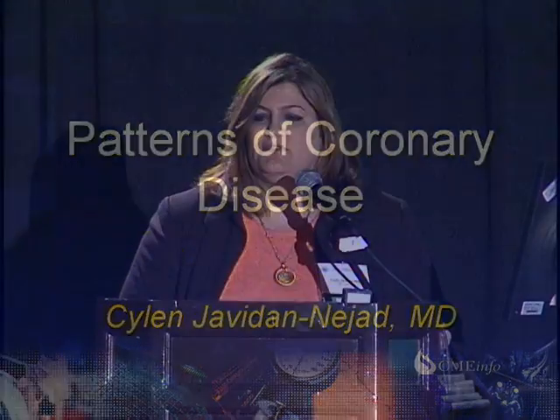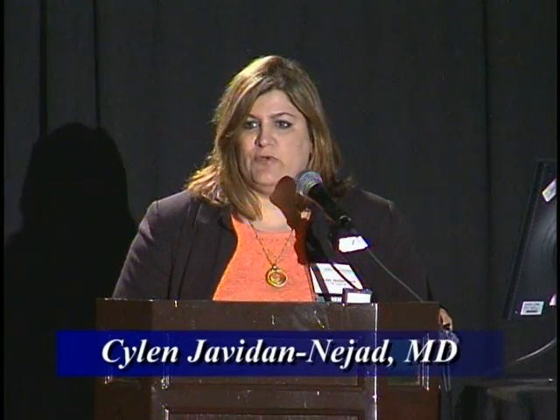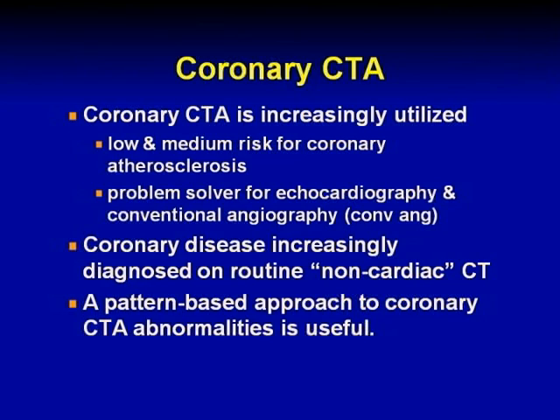Coronary CTA is increasingly utilized mainly for low and medium risk patients for coronary atherosclerosis. It is also a problem solver for people who've had echocardiography or conventional angiography, where the cardiologist can't make out what they're seeing anatomically, and then they go towards coronary CTA. So it's having an increasing role in radiology. Coronary diseases can also be diagnosed on routine non-cardiac CT, where there is no EKG gating. So it's good to know what the disease patterns could be and to have a pattern-based approach.